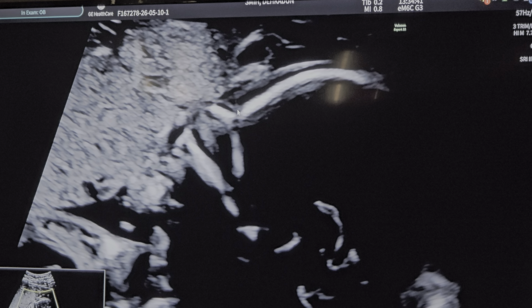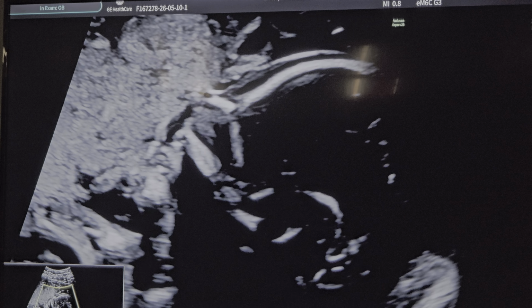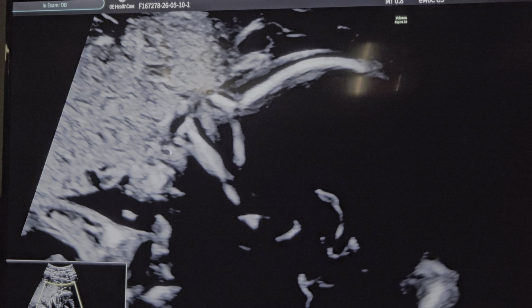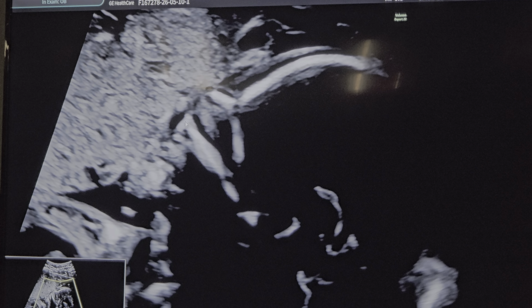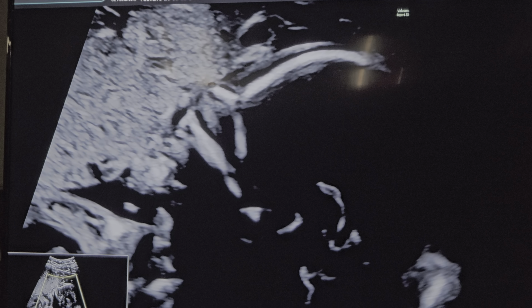Now one important thing which all of you should concentrate on as a screening marker for Down syndrome is the position of the tip of the tongue. Just concentrate on the tip of the tongue and the tip of the maxilla. This maxilla is never a box-shaped maxilla. It will go behind in trisomy 21. Is it too much, friends?